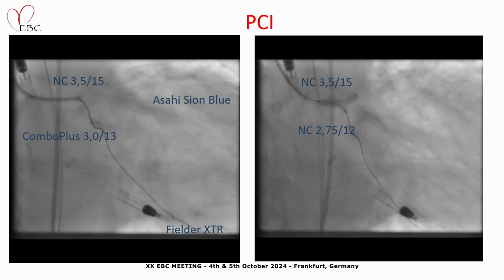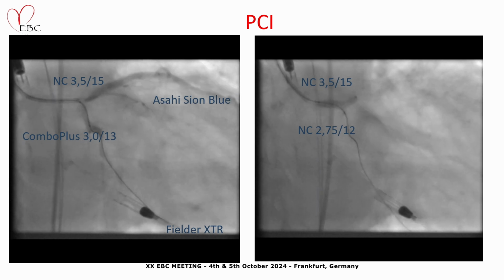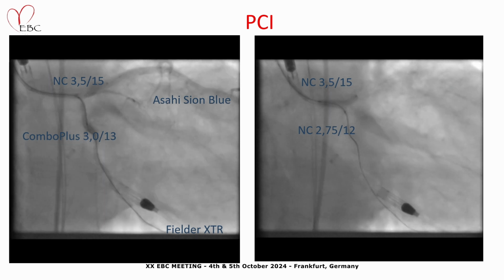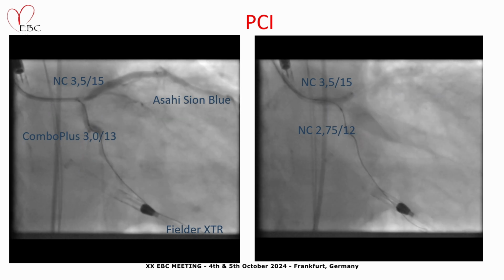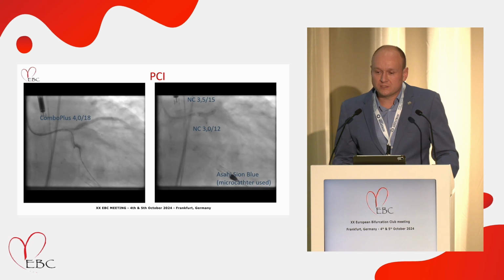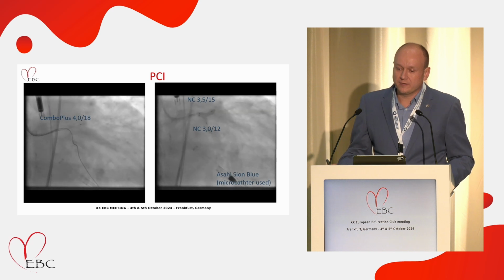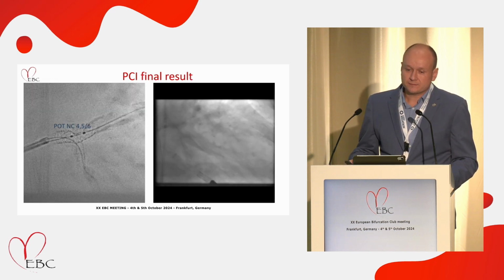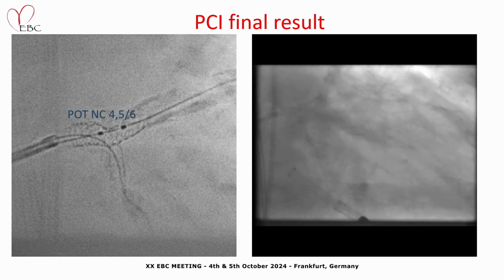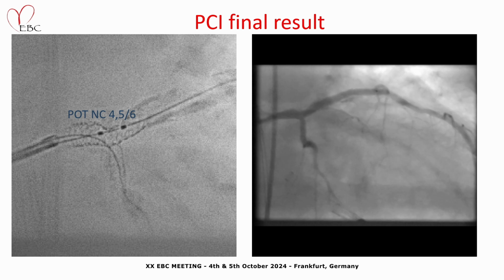We applied the reverse TAP technique, started with one stent implantation to the side branch, to the circ with minimal protrusion to left main, and then kissing non-compliant balloon dilatation. And then the stent in left main and LAD was implanted, rewiring and another kissing non-compliant balloon dilatation. Here is the final result. Thanks to ClearStent, it again isn't perfect, but it's better than in the first procedure.